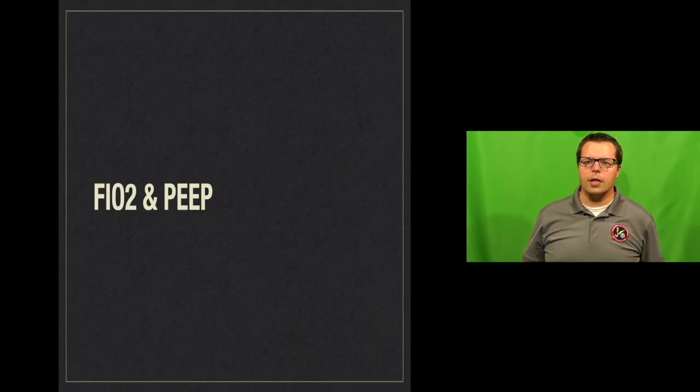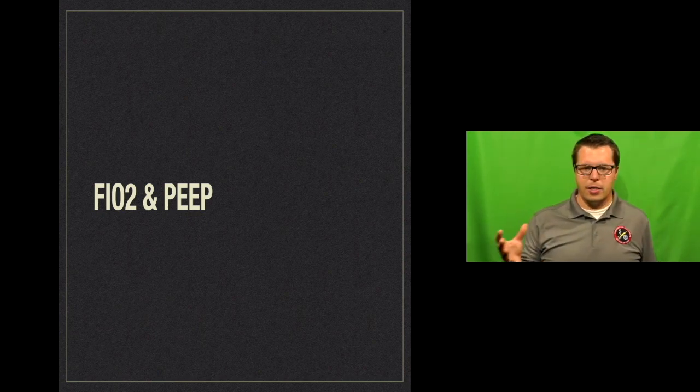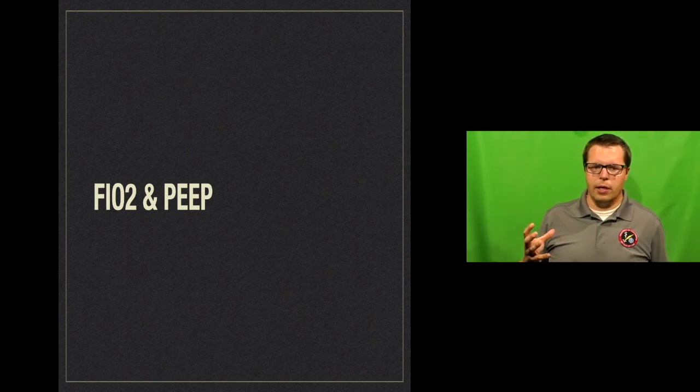So what's left on most ventilators to set up now is going to be the FiO2 and the PEEP. FiO2 stands for fraction of inspired oxygen, which is the percent of oxygen that you are delivering in each breath. And then PEEP is positive end expiratory pressure.